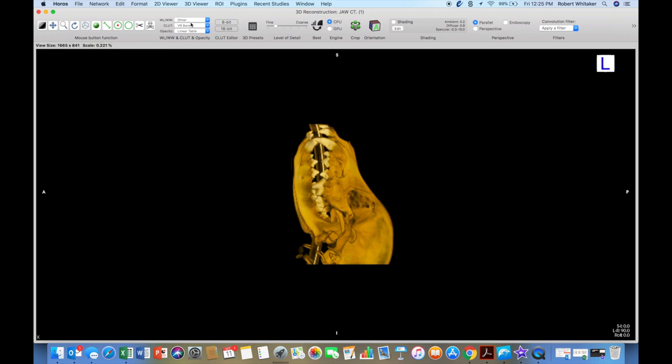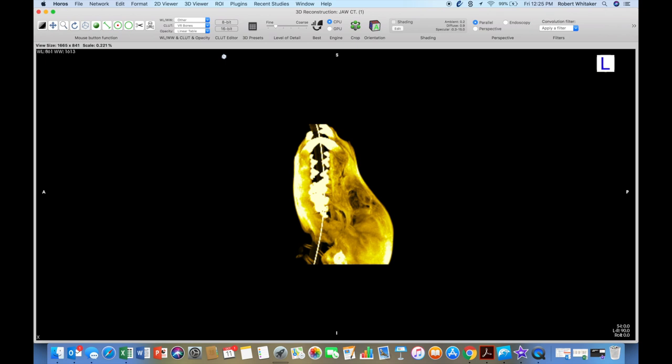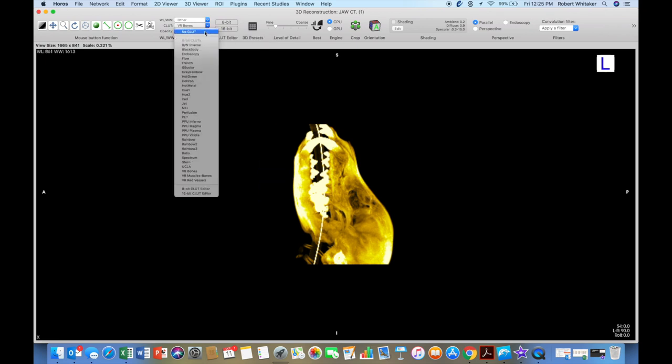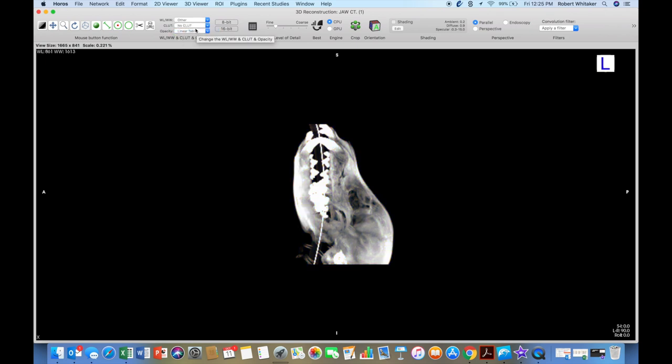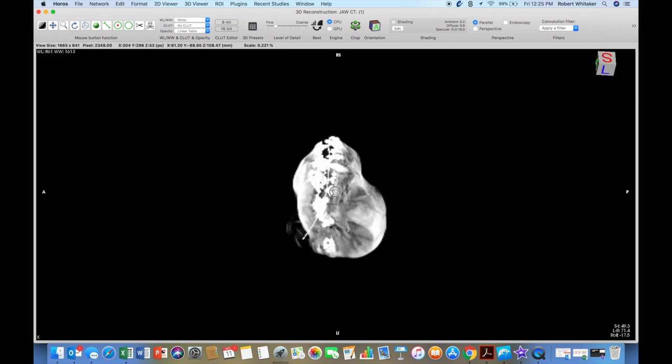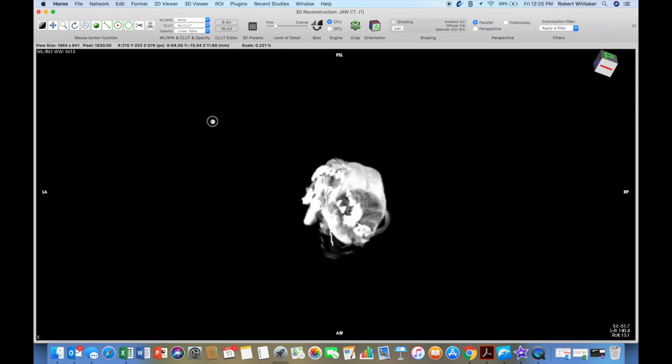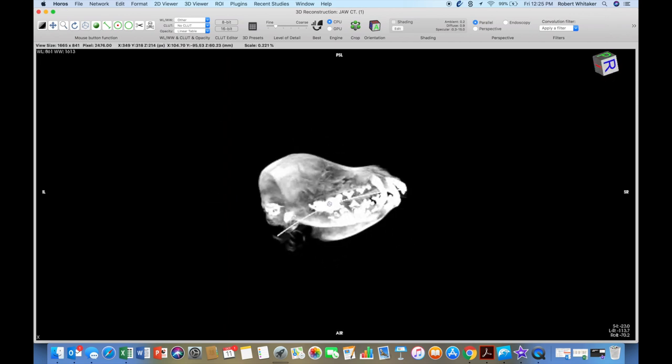You can also go to an MIP, either one. If you go to MIP, select the no CLUT, no CLUT, because that gives you the black and white view. We don't want any color in a maximum intensity view. We just want black and white.